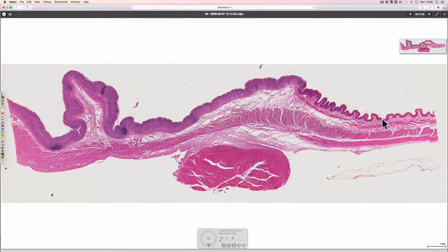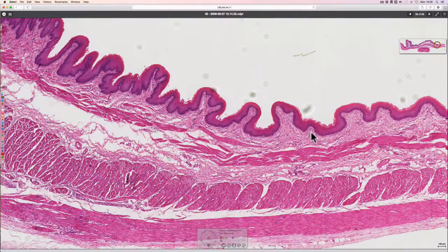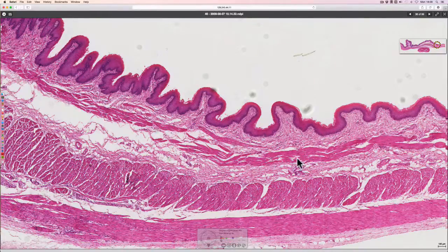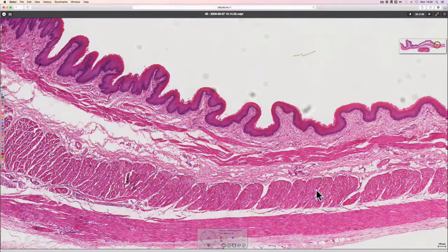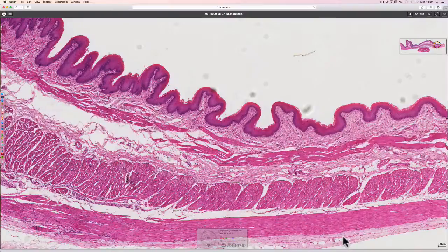The esophagus has a stratified squamous epithelium, then the lamina propria, and then the muscularis mucosa which causes the mucosa to be folded. Underneath that there's submucosa, and then we have our two layers of muscle allowing peristalsis, and then a connective tissue wrapping.